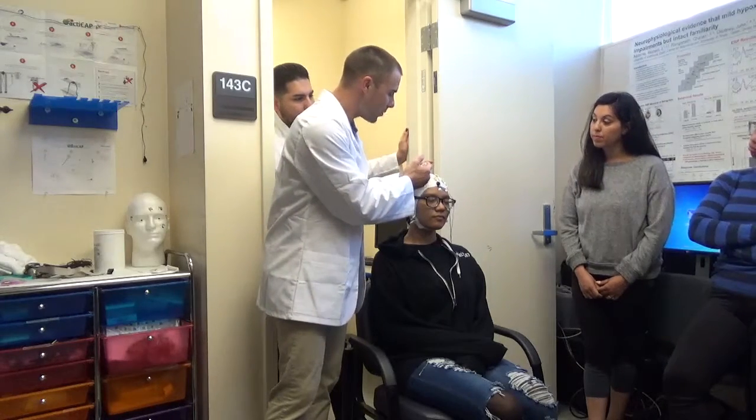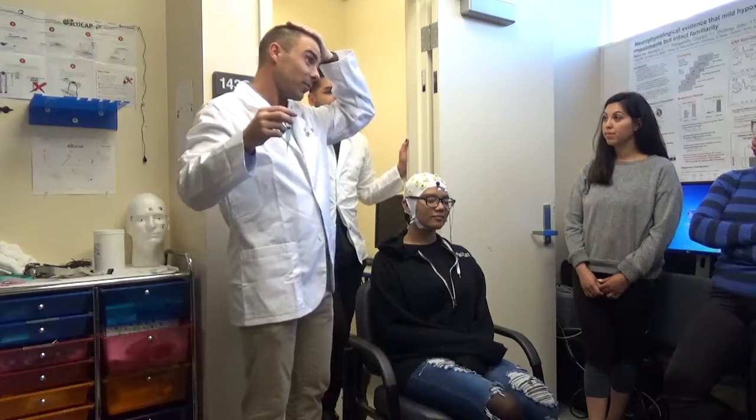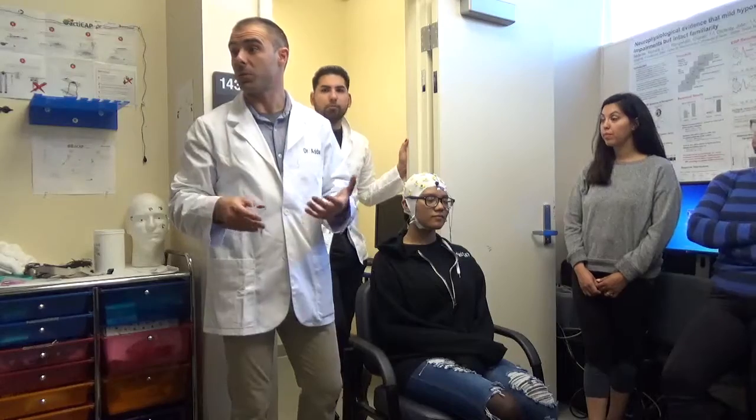That's what you're going to do. You're just going to move around. Now she's got some hair. If you put me down there, or you, there's not going to be a lot of hair there to get in the way. It's going to be a little bit easier. But the hair itself doesn't actually present that much of an impediment to successful recording. People would be surprised to know that. We get fantastic recordings from ladies with wonderfully long hair.